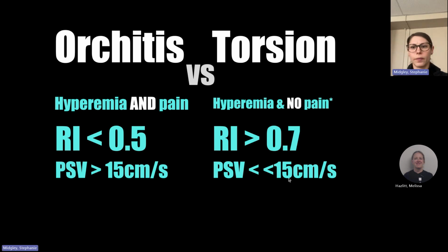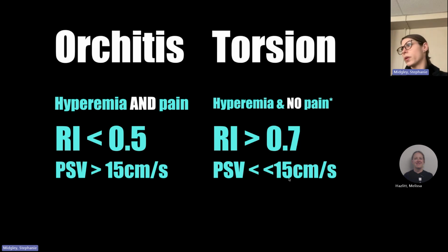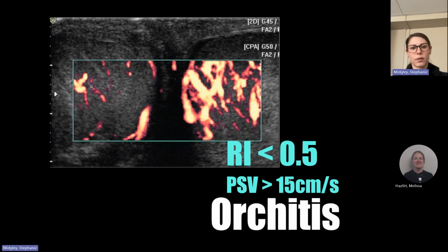Okay. Cool. Yes, we use what? How do you measure it though? You know how to do it, the spectral Doppler, and you just take the velocity. Okay. Yeah. My brain is escaping me on what it is. Okay. So again, low resistive index, high speed, orchitis. I think I have beaten that horse, right? Yeah, good. Okay.